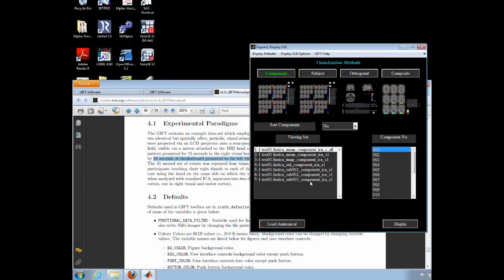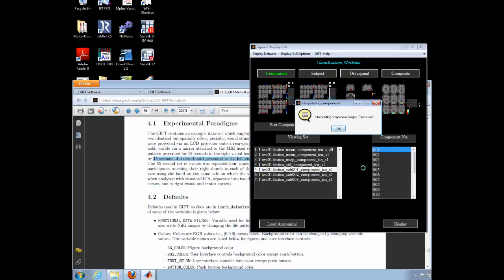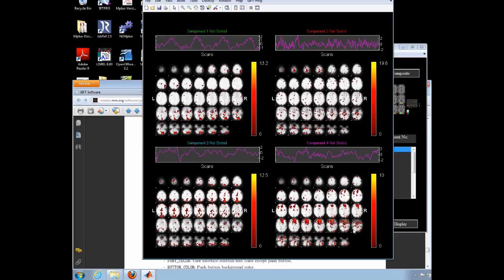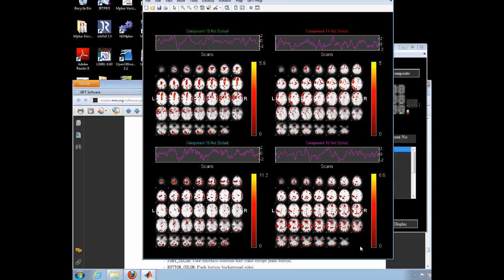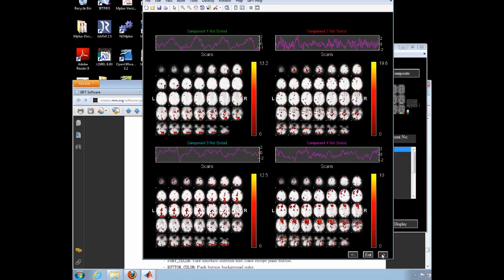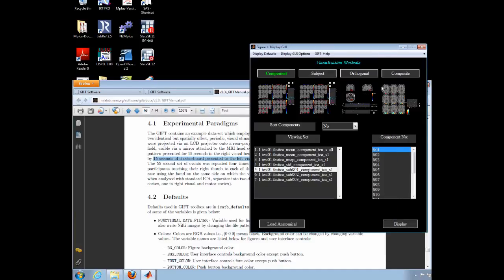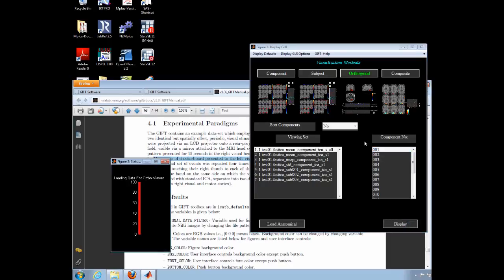You can see the same components for an individual subject. And you can also see the components from each axis of orientation, so that you can get a better idea of which brain areas have the pattern of activation you are interested in.